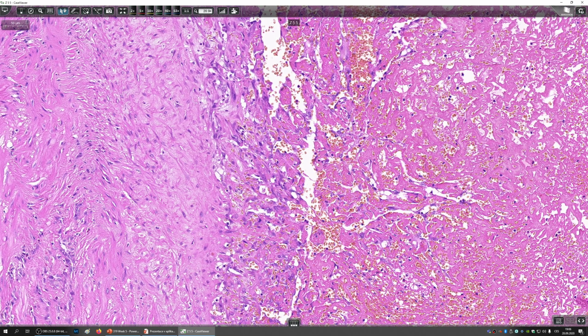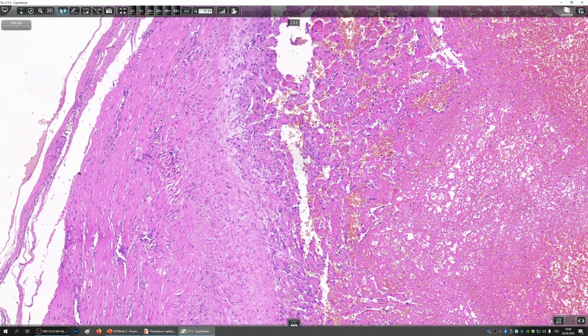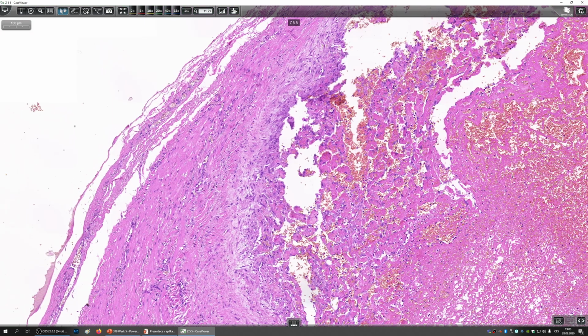So this is highly cellular collagen and blood vessels. This is the so-called granulation tissue. We also call it non-specific granulation tissue. This tissue is the universal scaffolding that you see when something is healing. So whether you have a scar which is developing after an infarction, after necrosis, or whether you have a healing wound, whether you have a thrombus in organization, you have non-specific granulation tissue. This is the first step in healing.